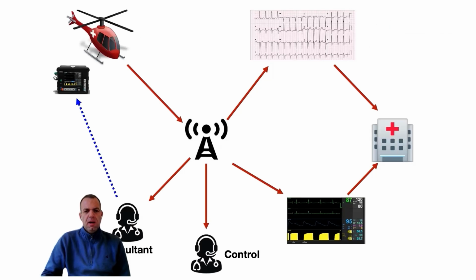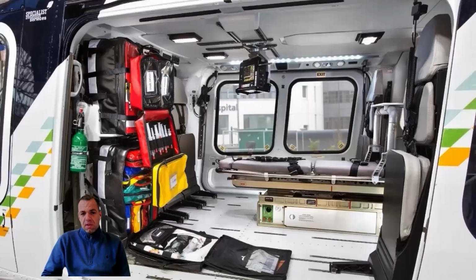So sometimes the crew will want to send me some physiological data. I've spoken to them and I just want to in future be able to push an acknowledge button that flashes up on the Tempus screen so that the crew know I've seen it, I'm aware, I'm there, I'm with them, but I haven't had to interrupt them by calling them back. There's just that closed loop acknowledgement. And we're taking this forward to the next level.